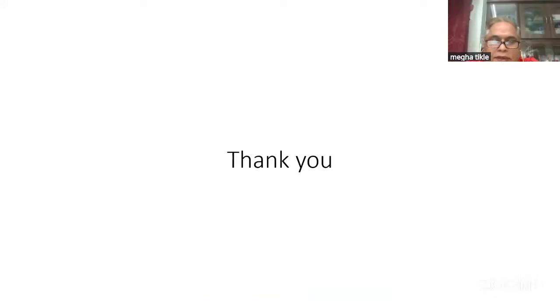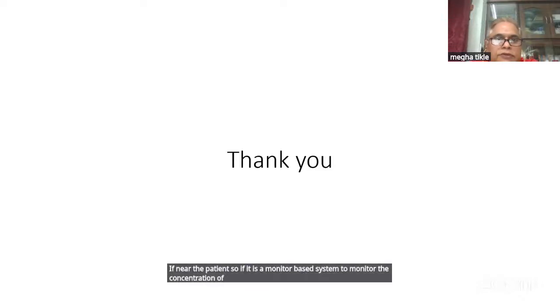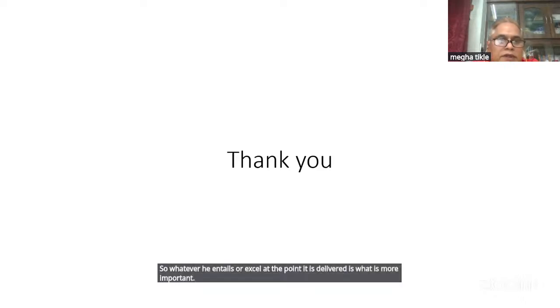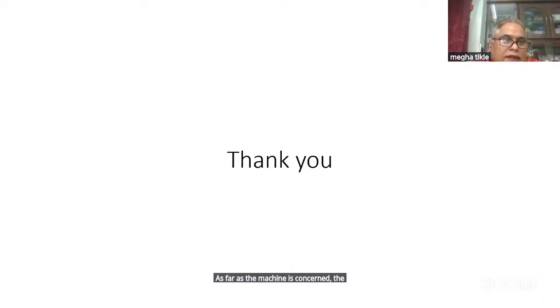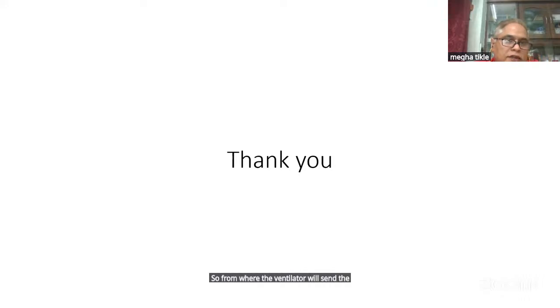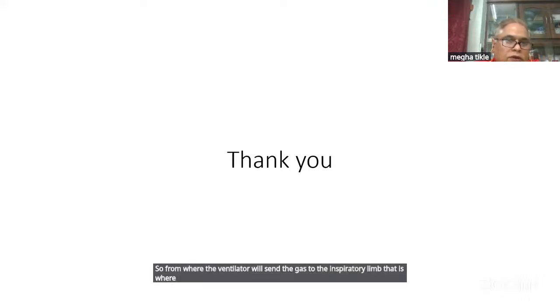The ideal position for the anesthesia gas monitoring system is near the patient. If it is a monitor-based system to monitor the concentration of oxygen or carbon dioxide or the mixture of gas, it should be near the patient. Whatever he inhales or exhales at the point which is delivered is what is more important. As far as the machine is concerned, the oxygen fuel cell or oxygen analyzer is just before the inspiratory limb. From where the ventilator will send the gas to the inspiratory limb, that is where the oxygen sensor or the analyzer is present.